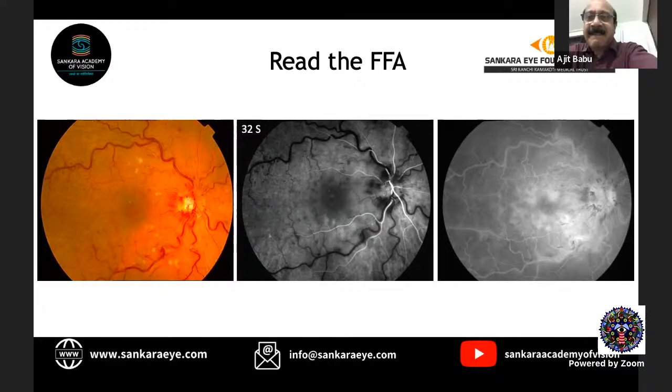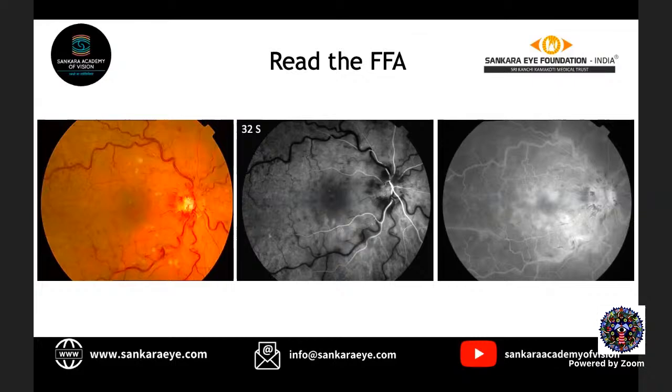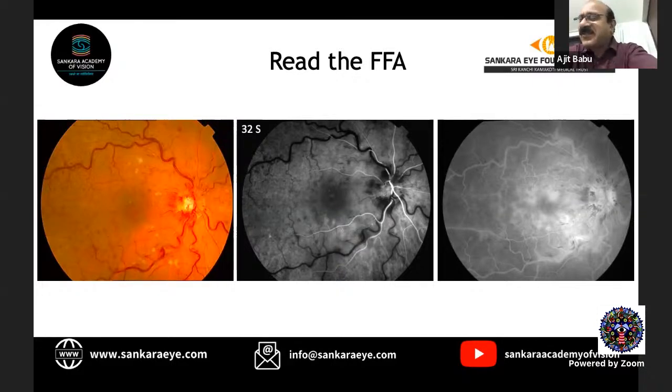Okay, sir. Retinal circulation time, how much is it? It's about 12 seconds. About 10 to 13, 15, don't worry.